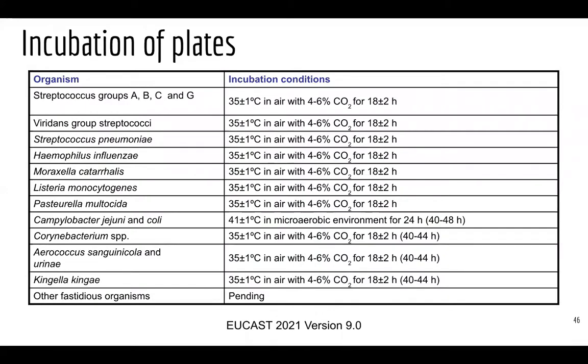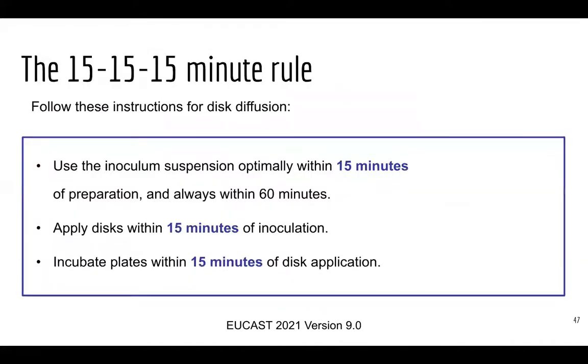Yeah, and I've just got a list of all the different incubation conditions, such as with the CO2, if they're fastidious or not. One of the take-home messages is, when you do the inoculation, do it within 15 minutes, and then apply the discs within 15 minutes after the inoculation. This is trying to say, don't do too many plates at once, otherwise you won't be able to stick to the 15-minute rule. Then again, if you are quality controlling this, then that should be taken care of.